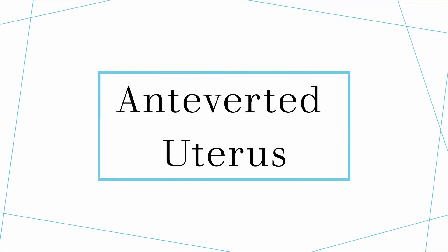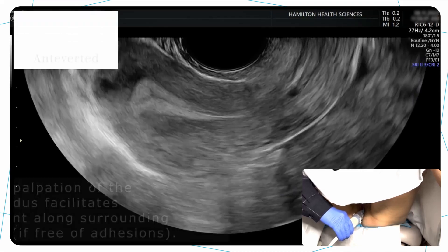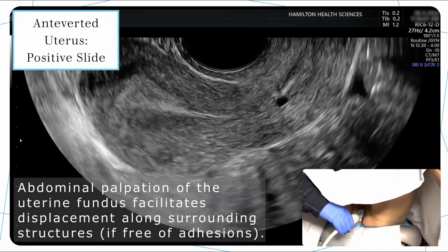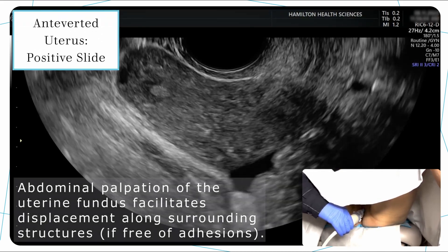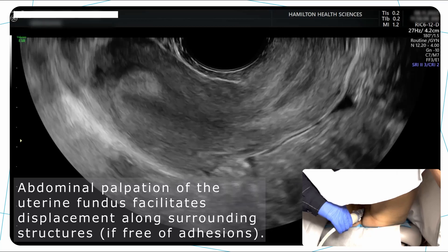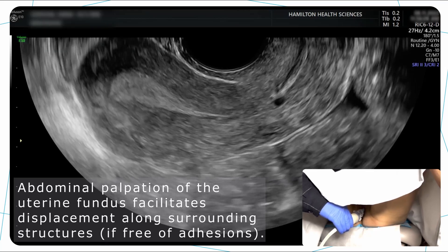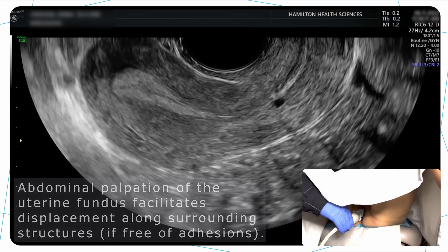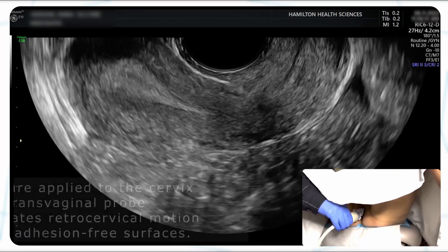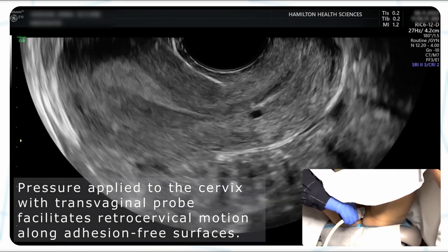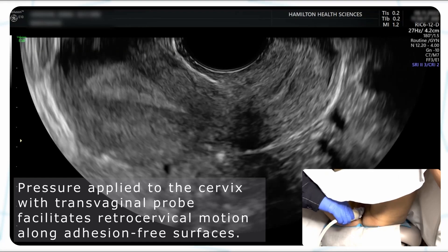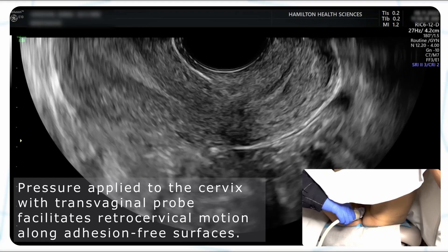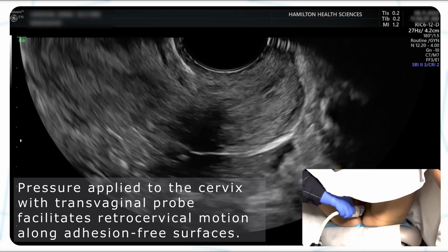In the first segment, we will display the positive sliding sign on the anteverted uterus. Pushing on the fundus of the uterus to elicit the sliding sign, we see that the uterus is moving down in the body while the bowel stays where it's meant to stay — the uterus is sliding along it. We can also apply the technique whereby we push with the probe on the cervix, and we see the sliding at the retrocervix.